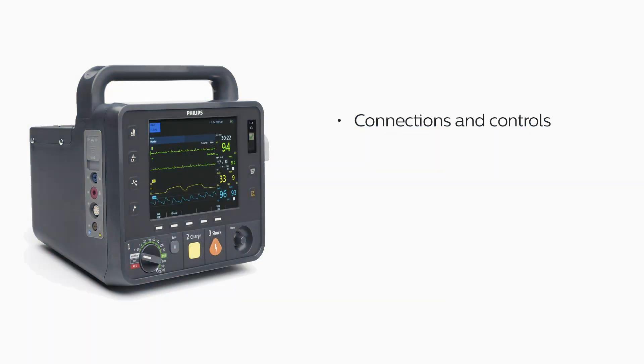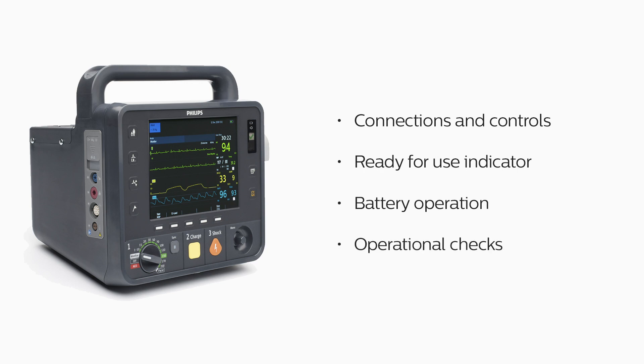Let's start with a look at the device's connections and controls, how to use the ready-for-use indicator, battery operation, and how to perform operational checks.